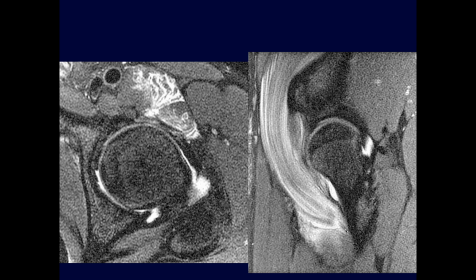Well, so what would you call this? If the sports medicine sub says what grade is it, what would you give them? Given that on the axial, it looks like there's maybe some fluid collections, maybe it's between a grade 1 and grade 2. Well, I think this is a pretty classic grade 1. The fibers are nicely intact. You don't see any focal fluid collections, and the edema is just along fiber tracks. I think this would be a grade 1.